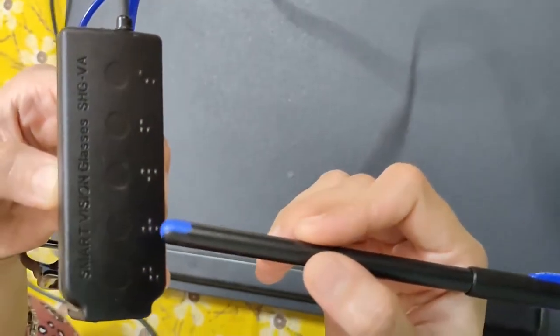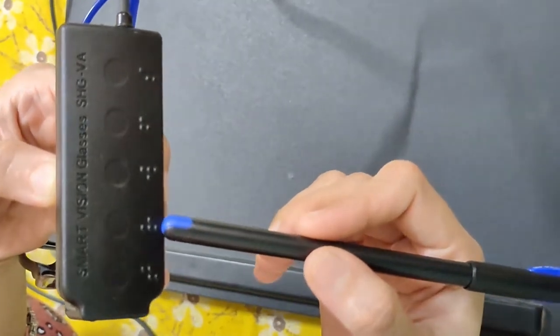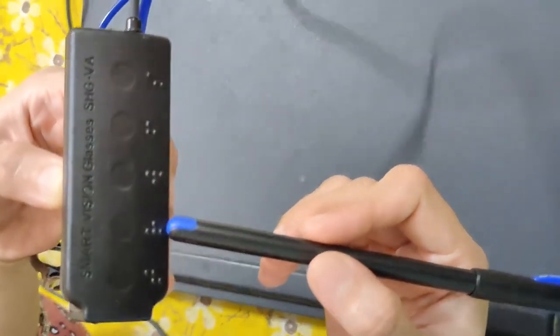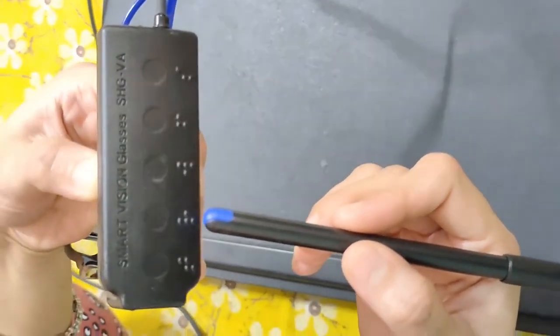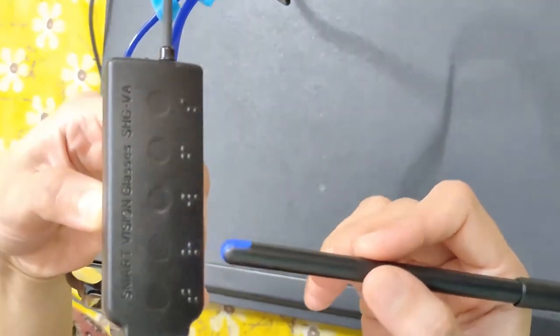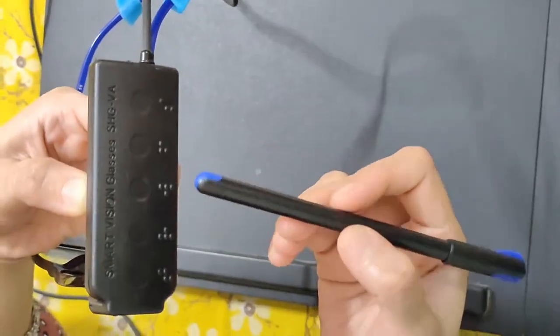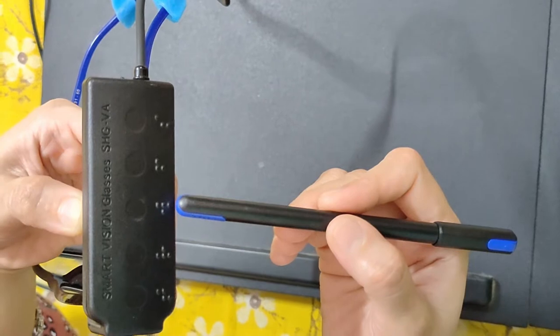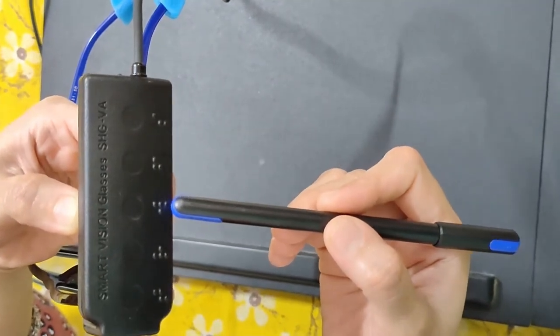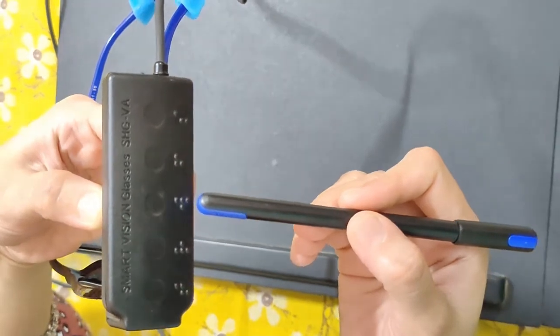The second knob is marked R in braille, which stands for the reading application. If you double tap this knob it will identify the currency. The third one is marked W in braille, which will help you with walking assistance.